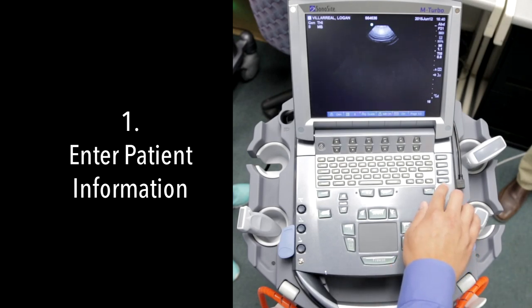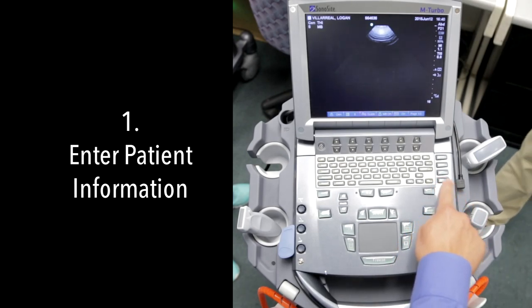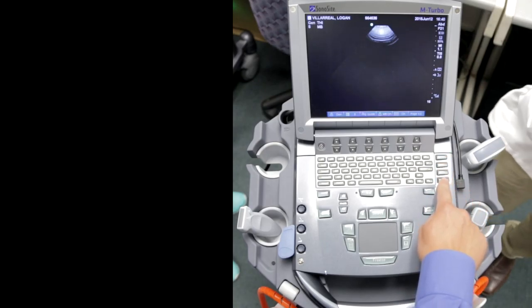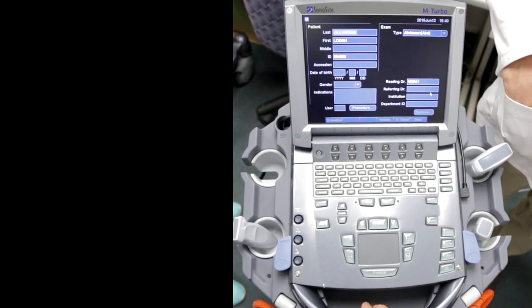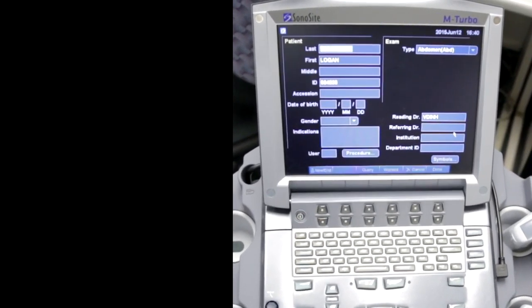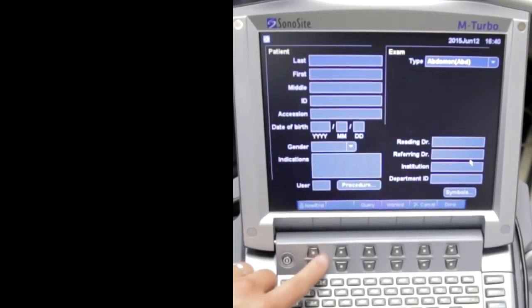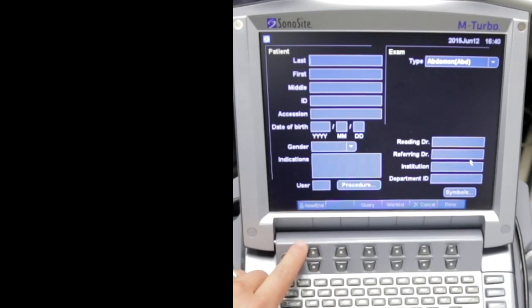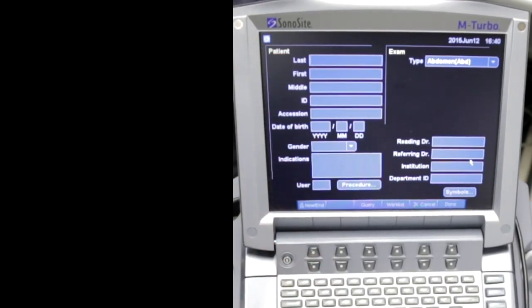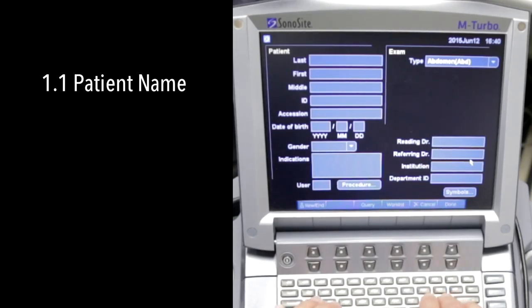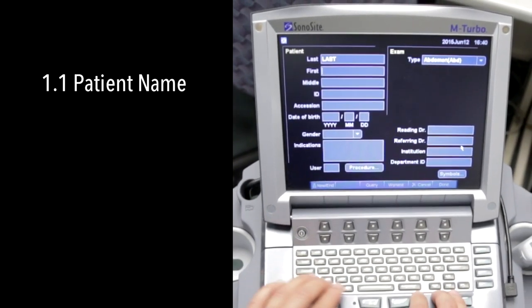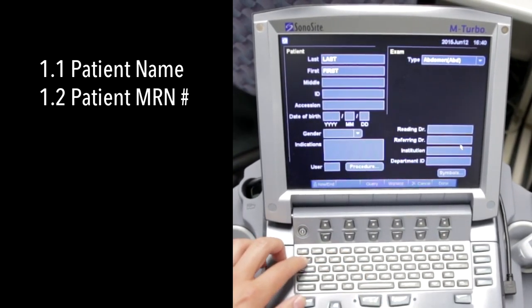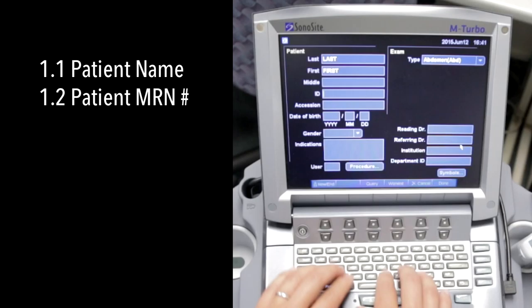The first thing you want to do is push patient, which is on the right side. When you push patient, this is to enter a new patient on the left side, and here you're going to put the patient's last name. Then you push tab for their ID number here.